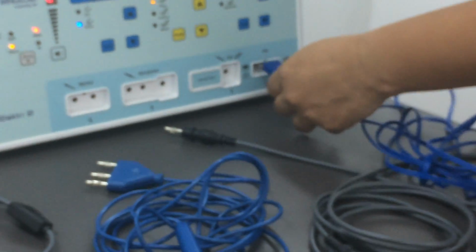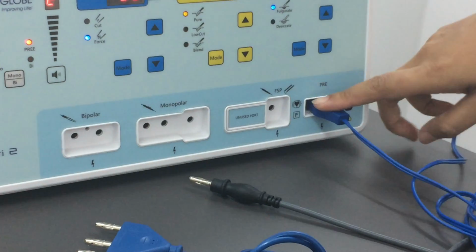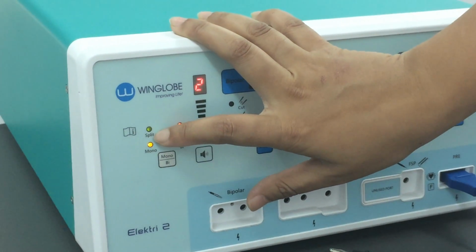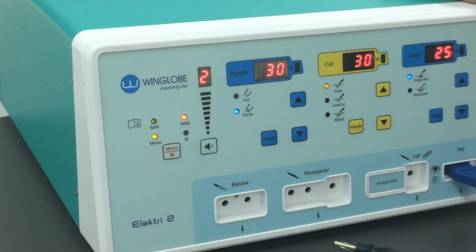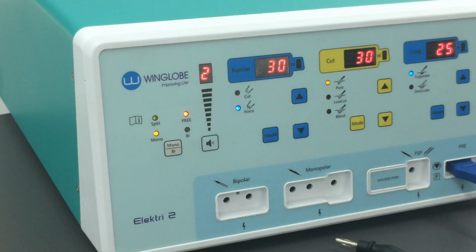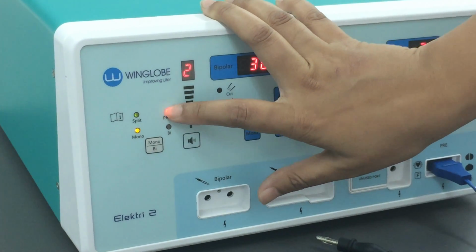So I will first connect the patient return electrode. The minute I have connected, you can see that the split green light has switched on, which means that the machine is indicating that we have connected a split patient plate. But because it is not connected to the patient up till now, it is still showing an error.